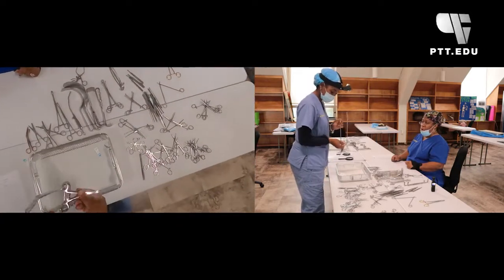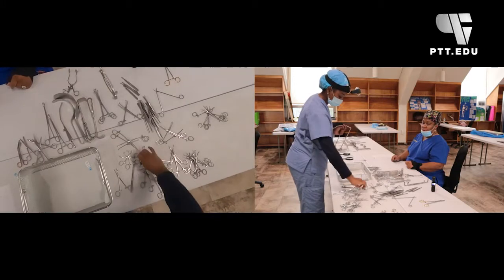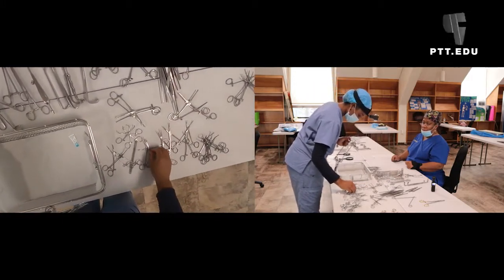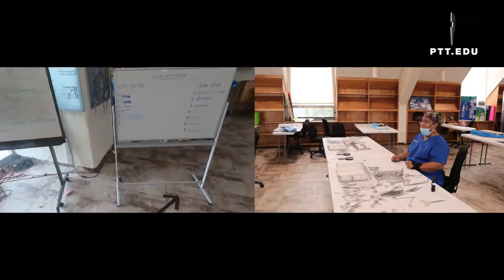Very good. All curved instruments going in the same direction. Very good, Ms. Griffin. Ooh, curved. Oh, exactly.